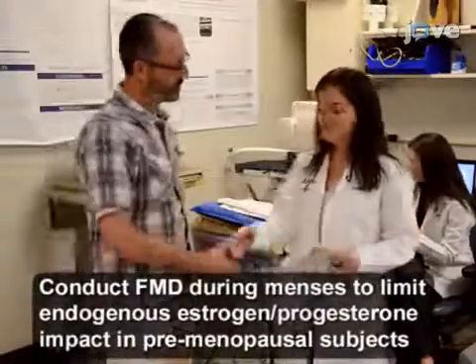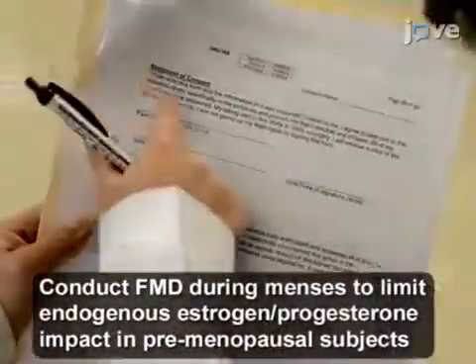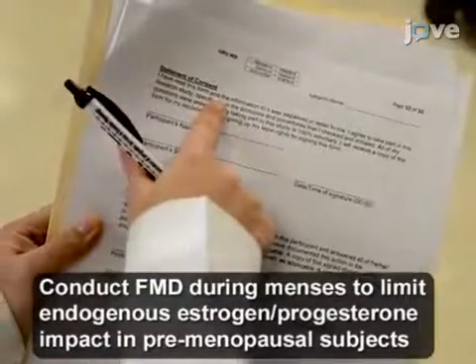The participant has abstained for at least 12 hours from exercising, smoking, and high-fat meals, and for at least 72 hours from vitamin supplementation and aspirins, and at least 24 hours from non-steroidal anti-inflammatory agents.